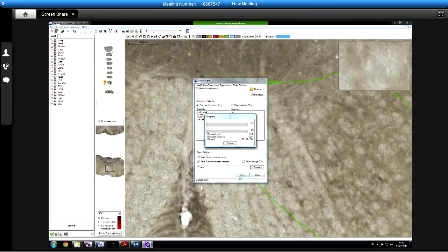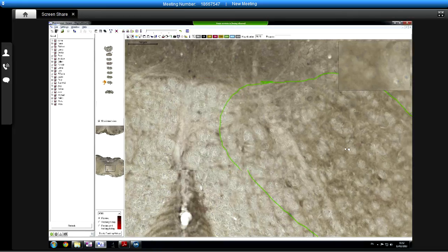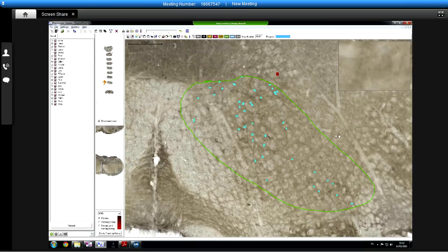So, first of all, before we look at data files and things, the first thing you can do at this stage is click on the I button here and say show measurement annotations. That just shows you what is being measured. This is maybe pretty, but more importantly at this stage, it allows you to have a quick look and go, have we got the right idea here?